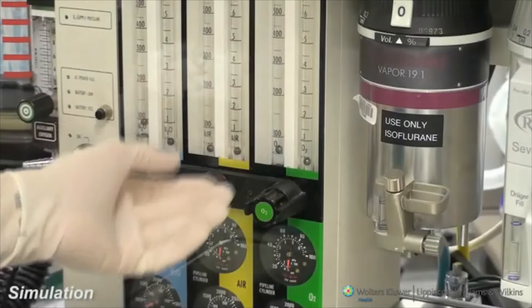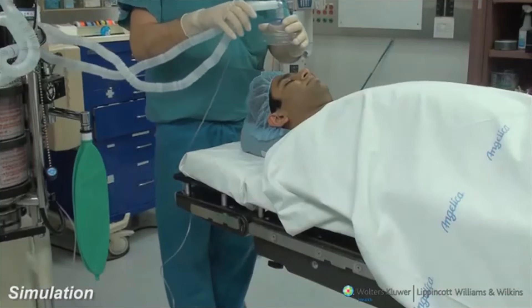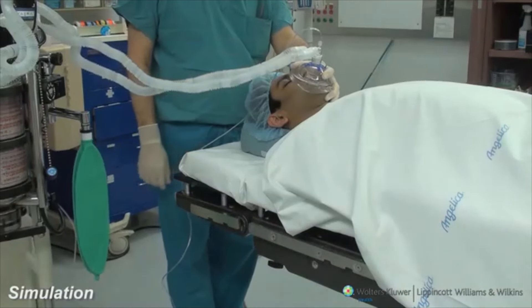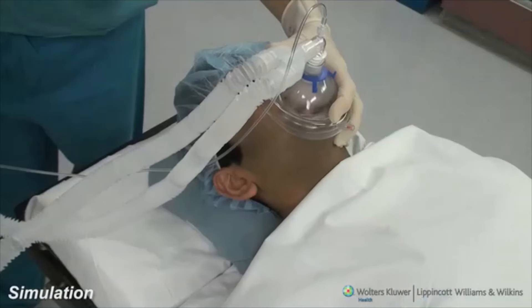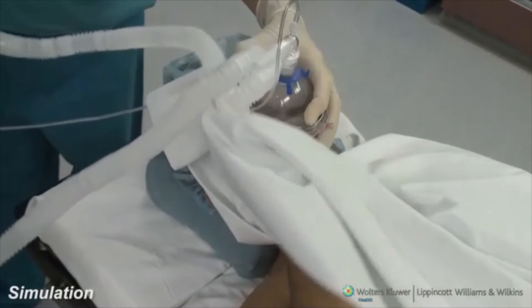If the mask is applied without a fresh gas flow of oxygen, the reservoir bag will eventually collapse and the patient will not be able to inspire, generating negative pressures within the breathing circuit. This is extremely uncomfortable and disconcerting for the patient who may become agitated.